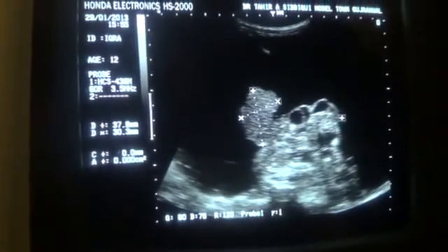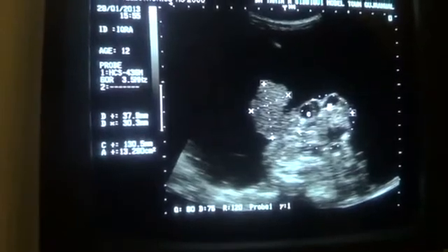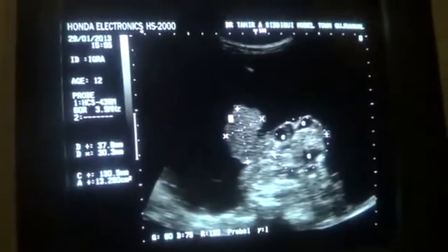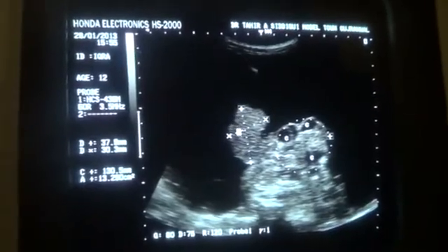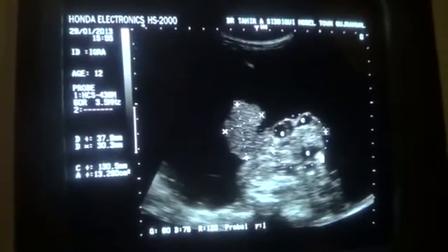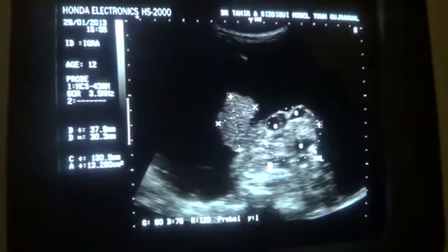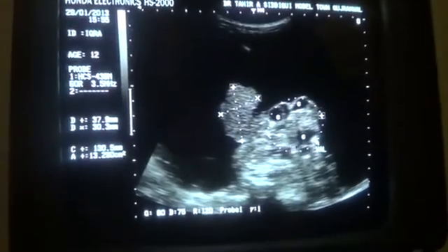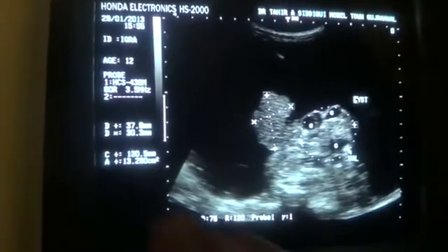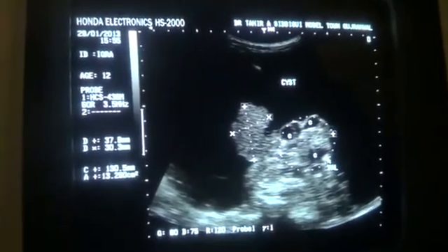If I consider this area as another part, then this is a cyst, this is a cyst, this is a cyst, and this is an evenly echogenic solid area measuring 37 by 30 millimeters. No posterior wall acoustic enhancement, no calcification is seen. However, this is a tiny area with posterior shadowing. This is the calcification in this particular well-demarcated multicystic area, and this region by itself is all cyst. I have decreased the gain to see this so that you are not seeing any other echoes or septa within this view.